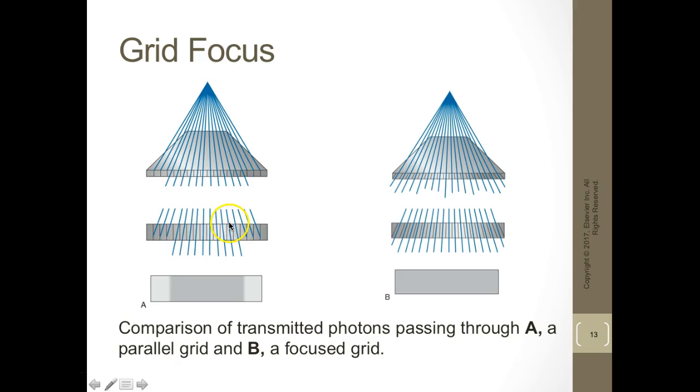As you can see with the divergent beam, it's absorbing your divergent beam because it's only going to allow the photons going straight to hit the image receptor. So you can see we have grid cutoff on the sides, and when we get into your next level physics class, we're going to actually calculate that.